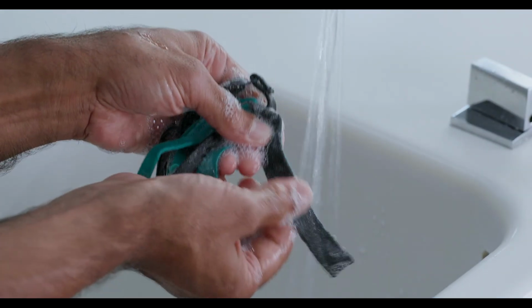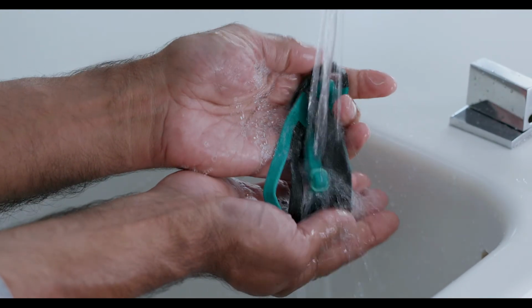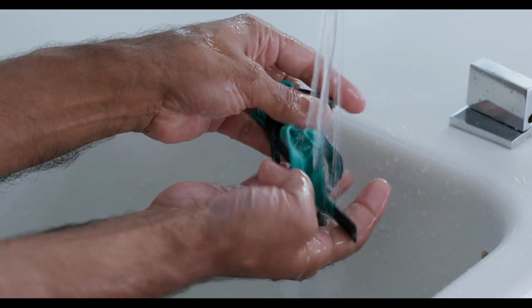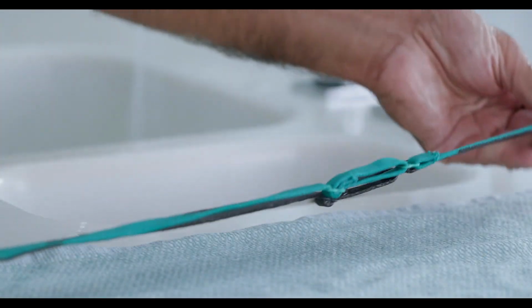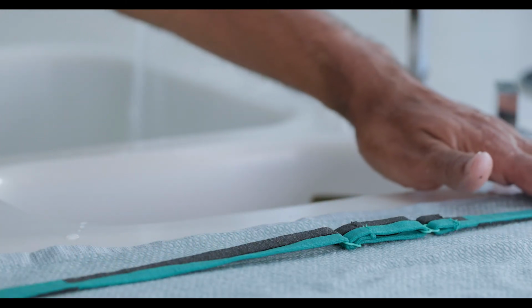The fabric headgear should be hand-washed weekly or as needed, using mild liquid dishwashing detergent. After rinsing, spread it out flat or hang it on a line to dry. Do not place mask parts in a clothes dryer.